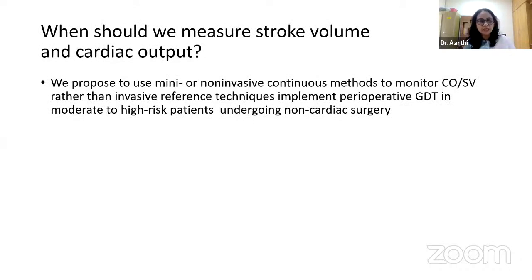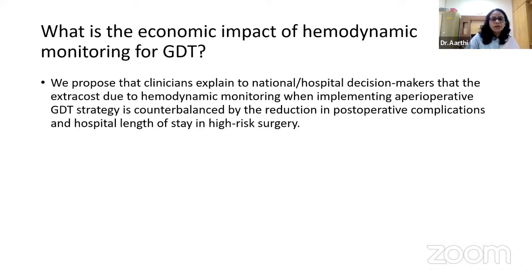We propose to use mini or non-invasive continuous methods to monitor cardiac output or stroke volume rather than the invasive reference technique, implemented in perioperative goal-directed therapy in moderate to high-risk patients undergoing non-cardiac surgery. And as the clinical scenario becomes more and more complex, and the patient's need for invasive monitoring increases, we implement more and more invasive monitoring. We also need to talk about the economic impact of hemodynamic monitoring for goal-directed therapy. That definitely has to be looked at, the economic impact of the advanced hemodynamic monitoring used.